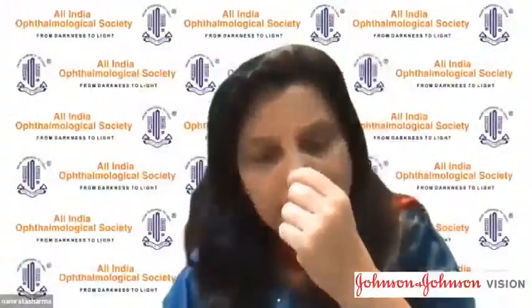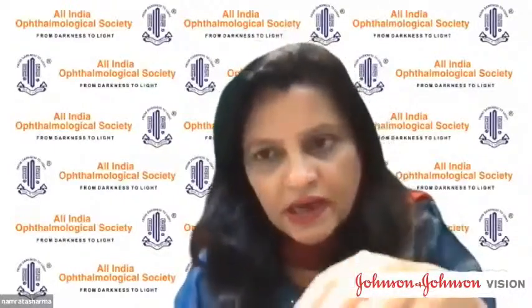Wonderful tips, Partha. And Namrata, quick one that you wanted to add? I just wanted to add, and I think Dr. Vasavada has also published the same, just a modification of that. When we do femtocataract, we actually have three cylinders, 2, 4, and 6 millimeters, and have three chops, 6 millimeters in length. And then block by block, we just eat up those things.